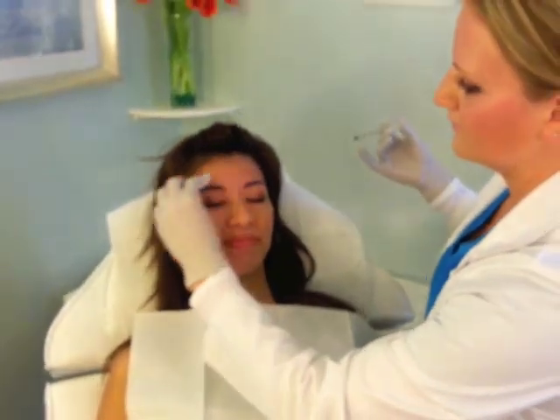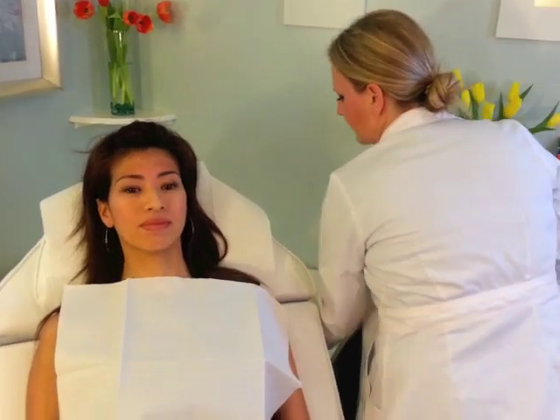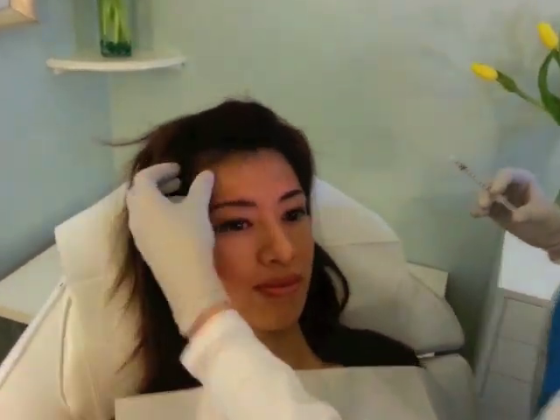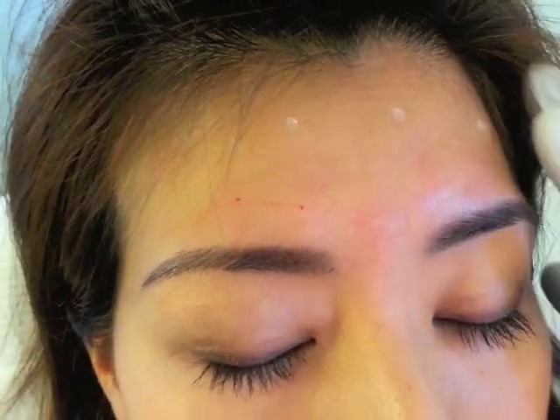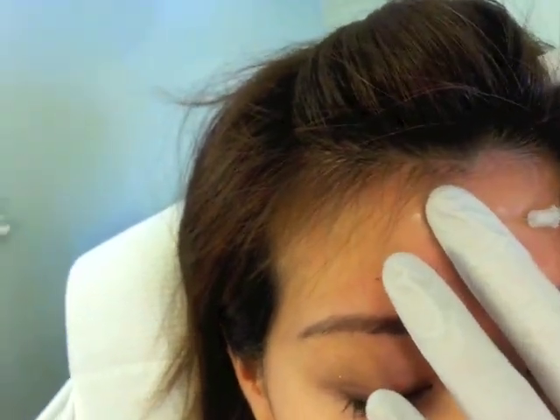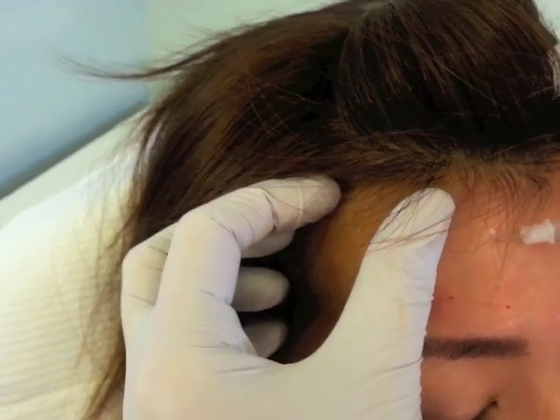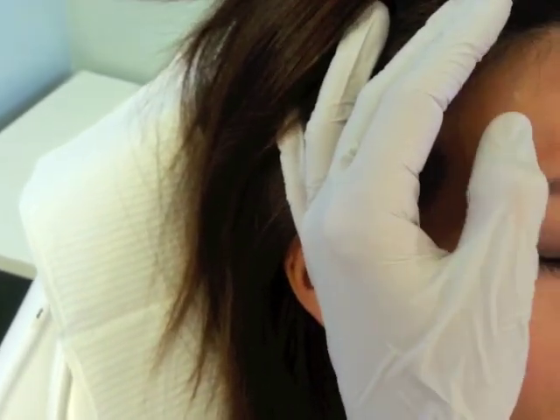That wasn't bad at all. Not at all — we usually just feel that tiny little prick of the needle and everything else is great. Now that we've done that, we're going to go ahead and do the forehead so we can stop that little ripple that you're worried about. These are injected a slightly different way. You just want to make sure to check for any larger veins. Almost finished — go ahead, up. Here we go.